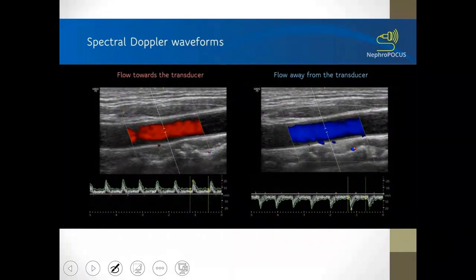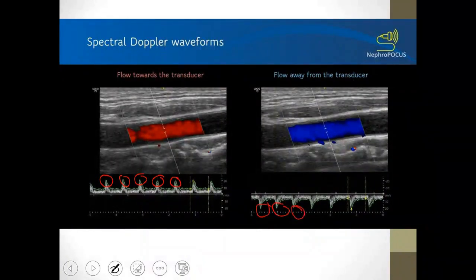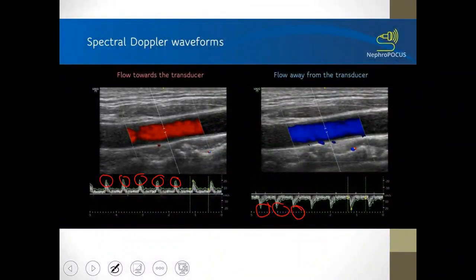You will find all the peaks here because it starts to show you the existing peaks. It starts to derive what some call the peak velocity, or the parameter from which it begins to calculate the velocity of the blood flow.